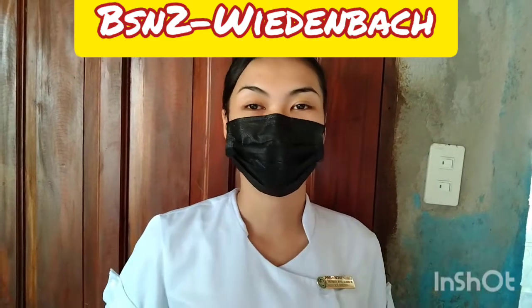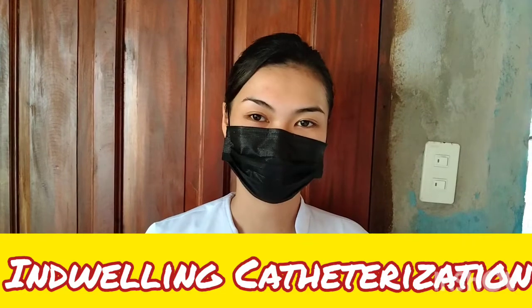For today's video, I am going to show you the procedure about assisting in catheterization. There are two types of catheterization. Number one is the straight catheterization and number two is the indwelling catheterization. And what is the definition? It is assisting in the introduction of a catheter into the bladder through the urethra for the relief of urinary retention or for emptying the bladder completely.